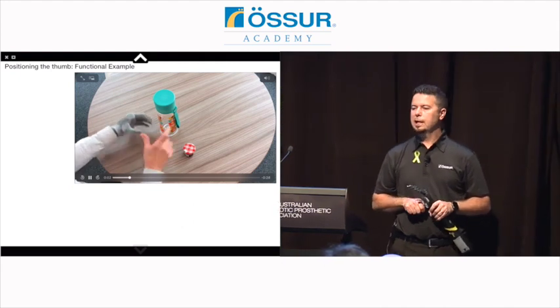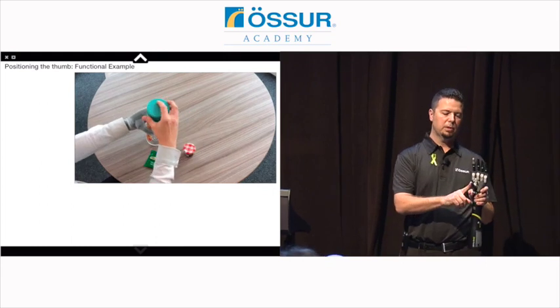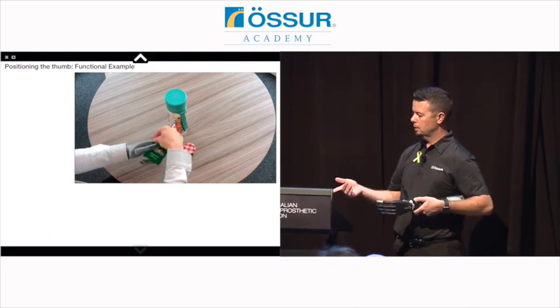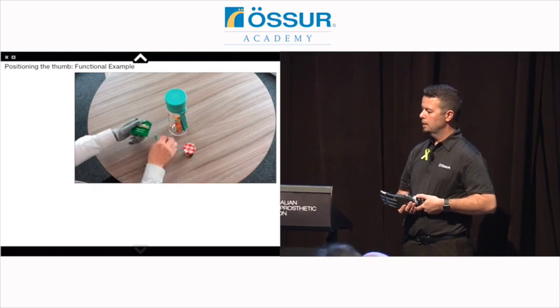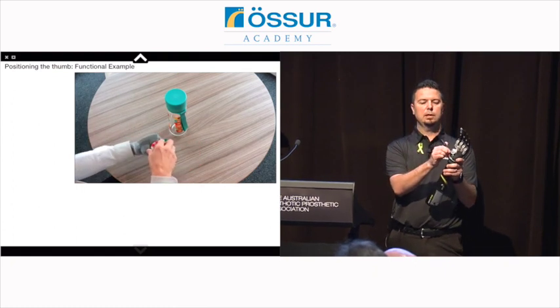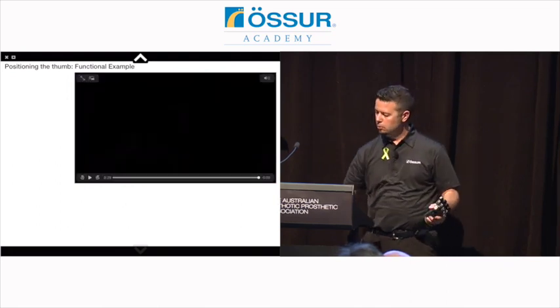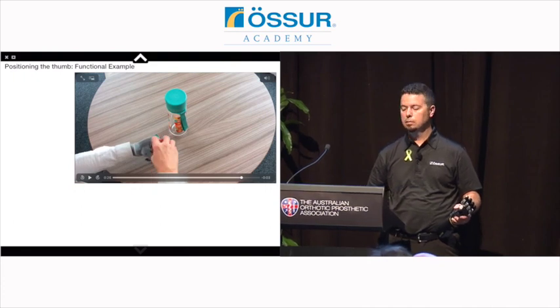Then it's nice to put little tasks in front of them, have them open the lid to this container, so the thumb has to be rotated into what I would call opposition. But then also rotate it all the way to the side for a lateral pinch for something like a tea bag or sugar pack. And then this little jar of jam is one of those examples where if she rotates the thumb all the way into the palm, it would hit the index and middle fingers before it would close on the object. So she rotates the thumb just ever so slightly to the side so that she can grab that jar.